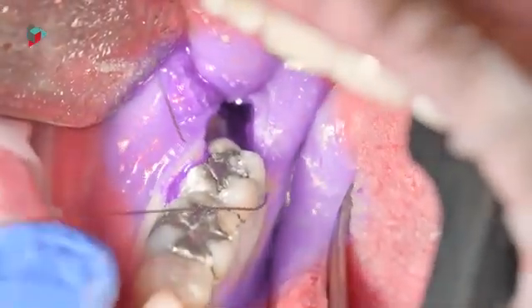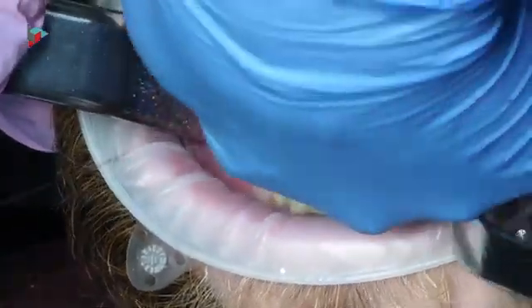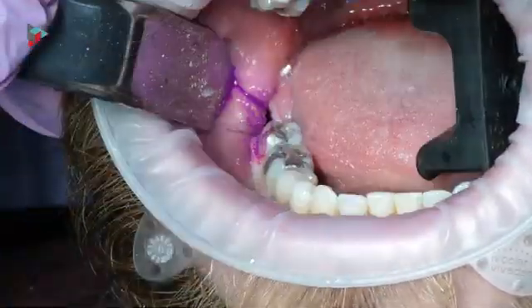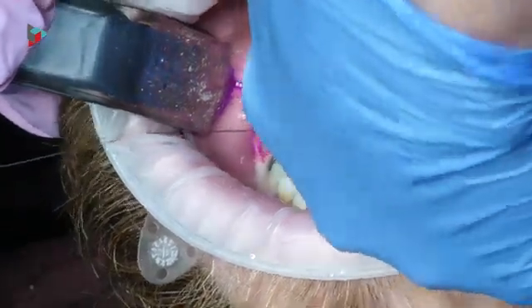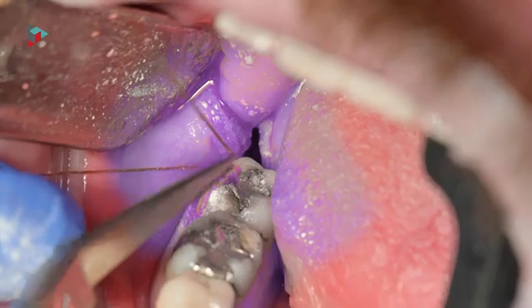After the tooth has been removed, the surgeon will close the incision with sutures and place a dressing over the area to protect it and help it heal. Pain medication and antibiotics may be prescribed to manage any discomfort or infection.